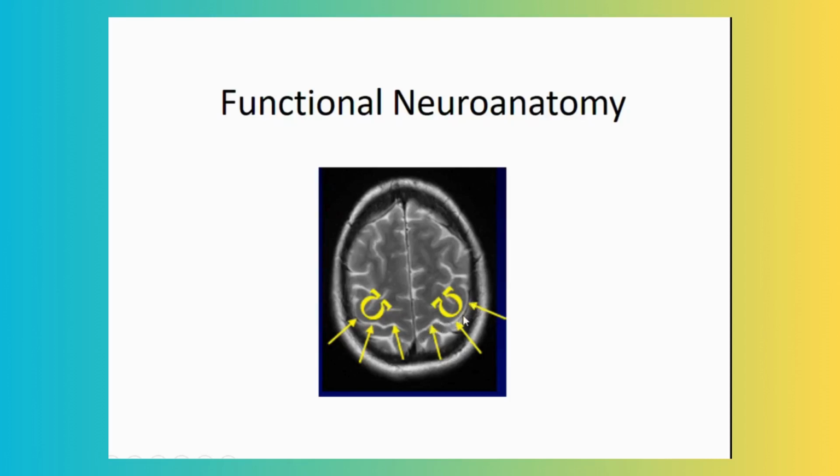And third is a bigger habit. Every time you open an MRI brain, try to identify the central sulcus, even if it is not in your reporting question. Still, it's a good habit to start looking at the central sulcus. And there is a hand knob, which is called the reverse omega sign. So this bump into the motor cortex or precentral gyrus is the hand knob. This is the hand motor area. The one medial to it is the foot motor area, and the one lateral to it is the tongue motor area.